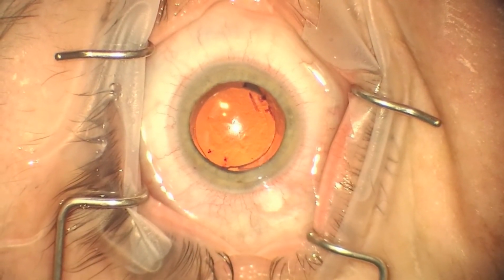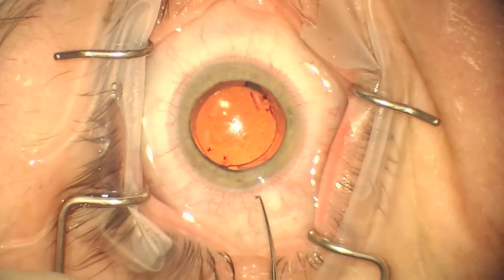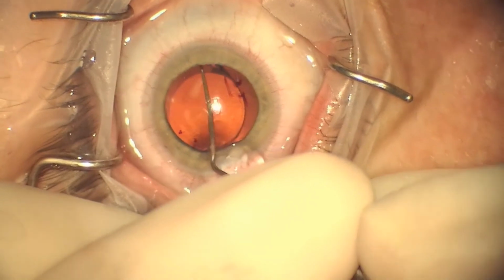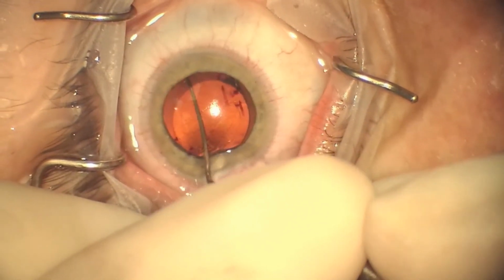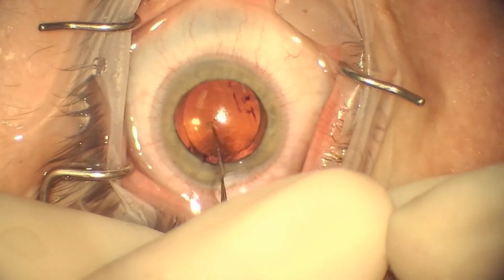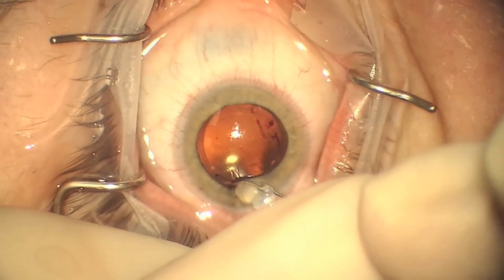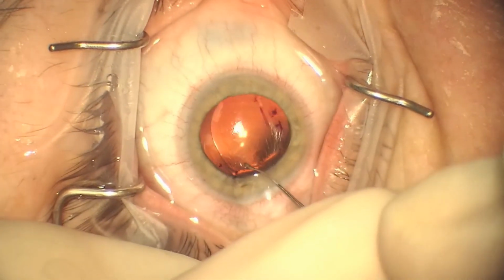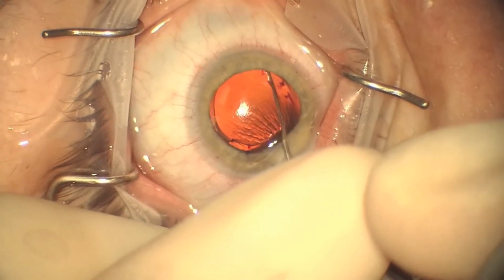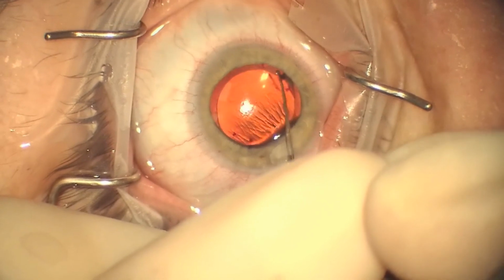We go through the original incision and insert viscoelastic to inflate the capsular bag. It's nice to use the original incision because you're not inducing any new surgically induced astigmatism. Once the haptics are freed from the posterior capsule, the lens can be rotated. This lens has only been in place for approximately a week and a half, and so it's quite easy to rotate.